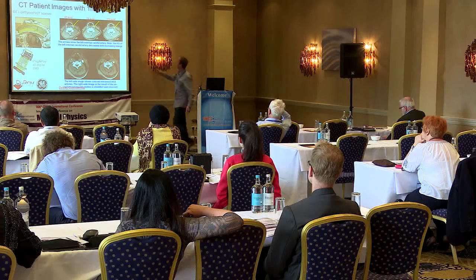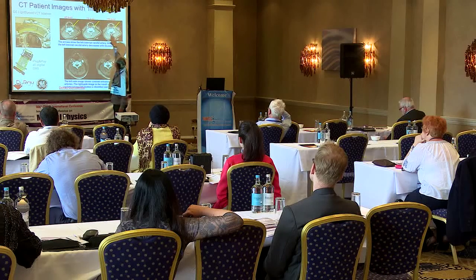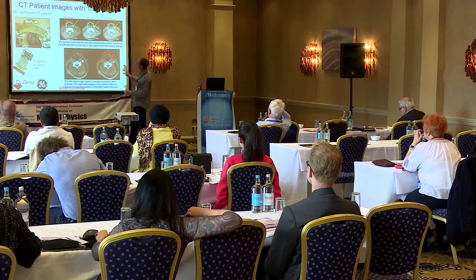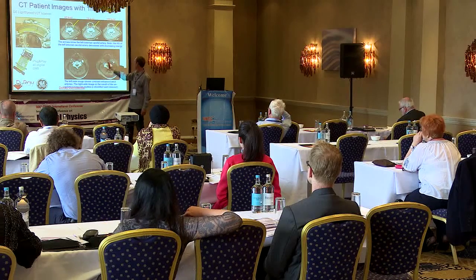So you can see that as the energy increases, the iodine goes away and the bone stays, and in this case this would be a plaque or a stenosis. The left side shows the contrast enhanced neck image.